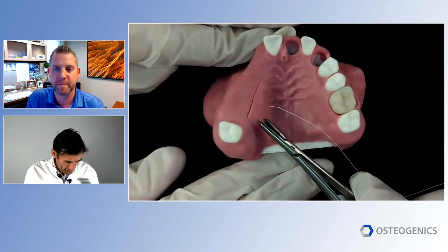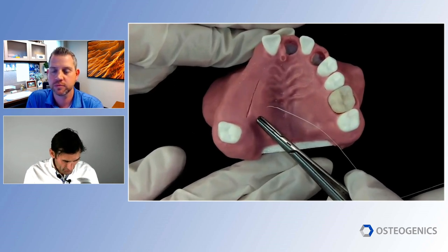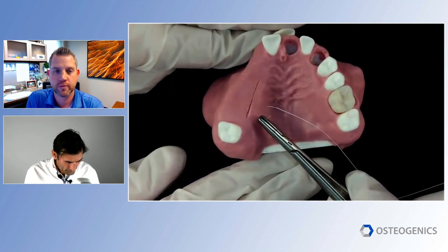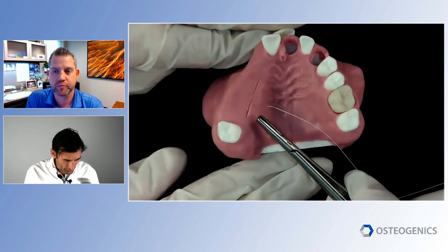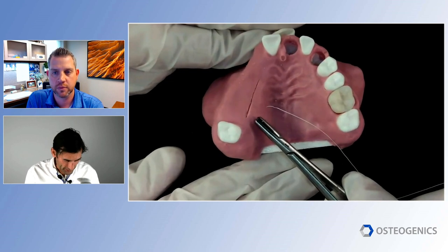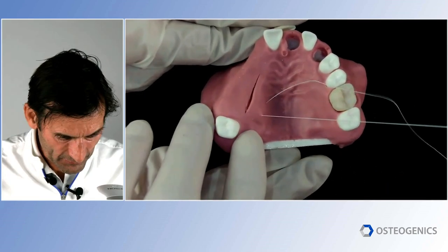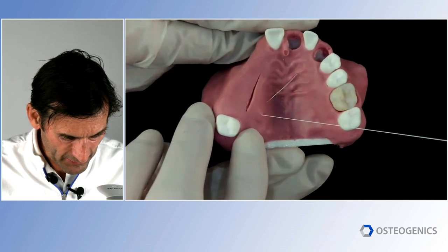Okay, Blake. No problem. Another thing I want to show you, and this can happen in surgery really quickly, is that when you're grabbing the needle, don't grab it at the needle point, because you're going to destroy the needle point, and it's going to be blunt very quickly. So always take it a little bit below it when you're pulling it out. So now I'm pulling it out. That's my PTFE right there.